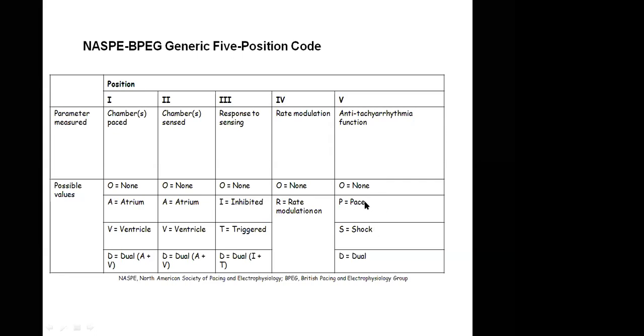Okay, so as I said, the anti-tachycardia pacing, as I explained, if a patient is going into VT at a rate of 180, the ICD can initiate anti-tachycardia pacing that will override that 180 by pacing the heart at 250. So the heart will always follow the one that is fastest. The heart will now start running at a rate of 250. After some seconds, the ICD can start decelerating the rate to 150, to 120 until it normalizes. So that's it. We have aborted a VT in the patient without shocking the patient. That's an anti-tachycardia pacing method.